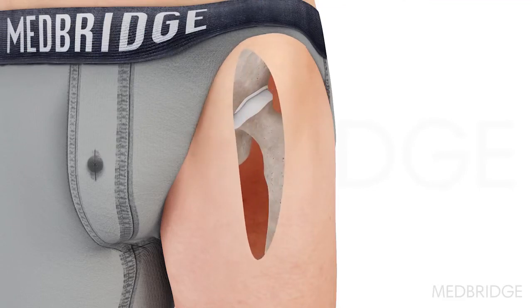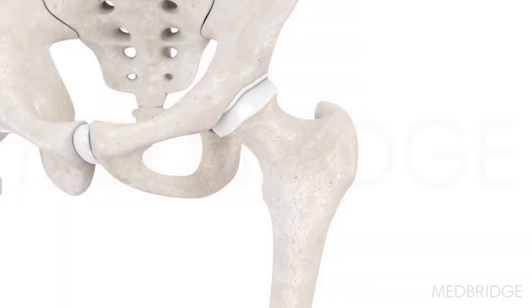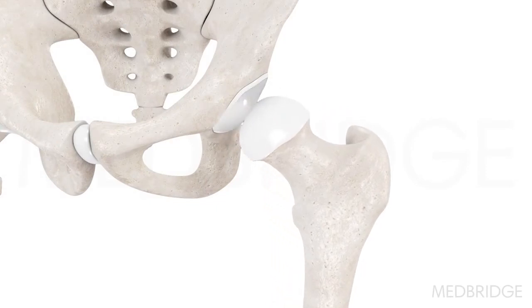An incision is made along the hip, either laterally or anteriorly. The muscles, tendon, and joint capsule are retracted to expose the joint. The hip is dislocated to further expose the surgical site.